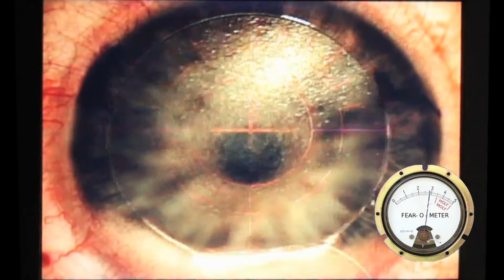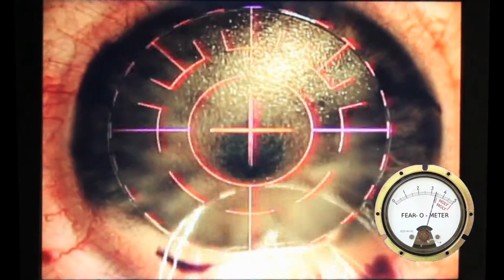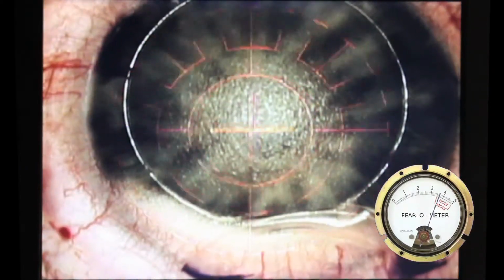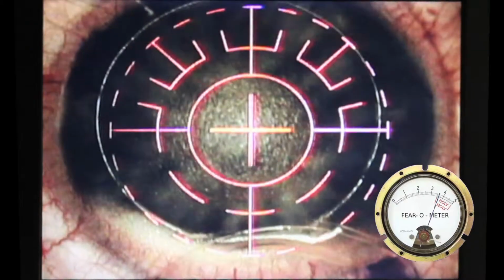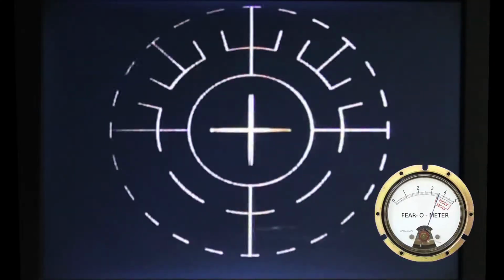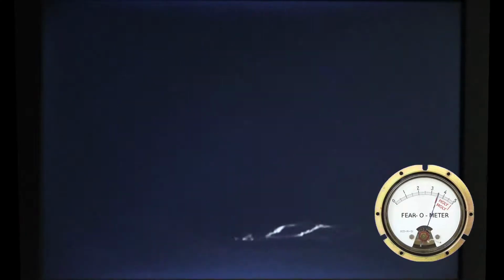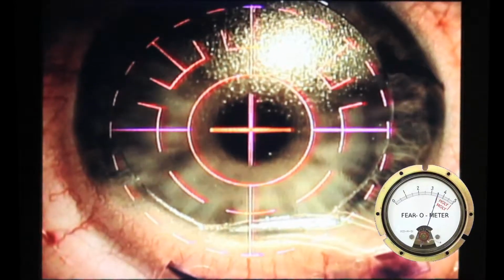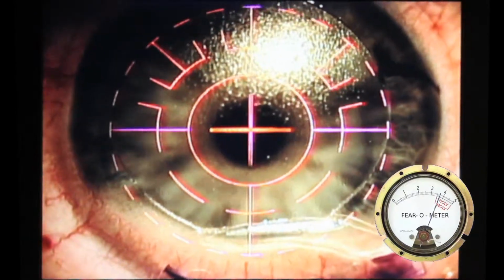When he pulls the flap back, it's like you're in some kind of spaceship because you're still trying to look at that little target that he told you to look at and stare at. So you're still looking as hard as you can, but everything is blurry, and I mean totally blurry. And then the lights go out, and he says, don't move, and he counts to 20. And while he's counting, the laser starts firing. Now, I'm told that this laser will lock on and not fire if you move or anything like that. But you can see here he has a lock, and he starts firing.